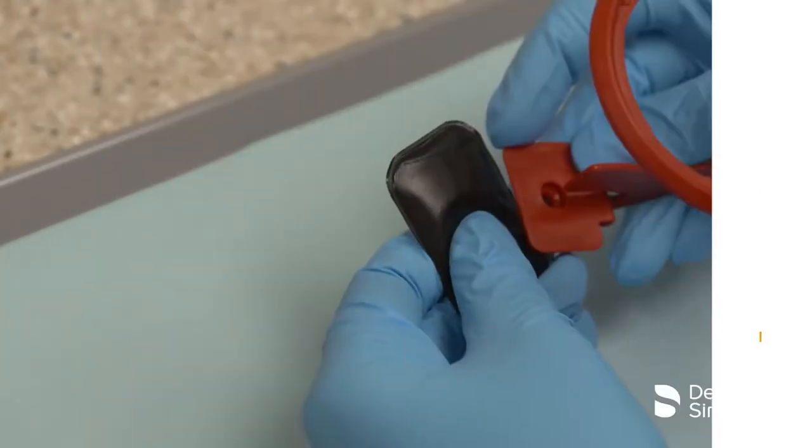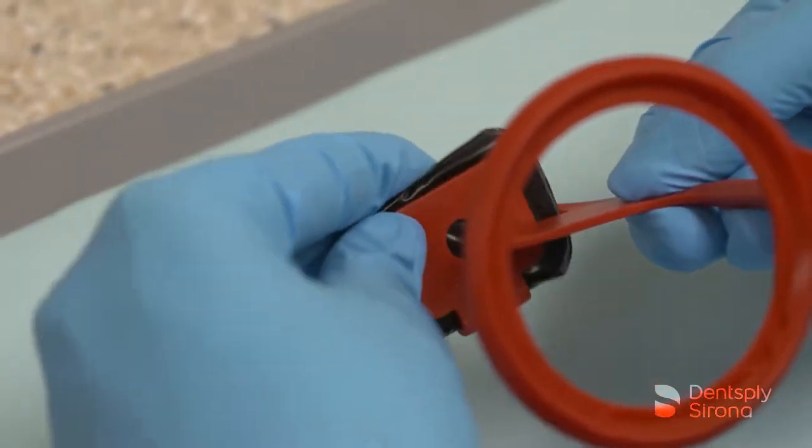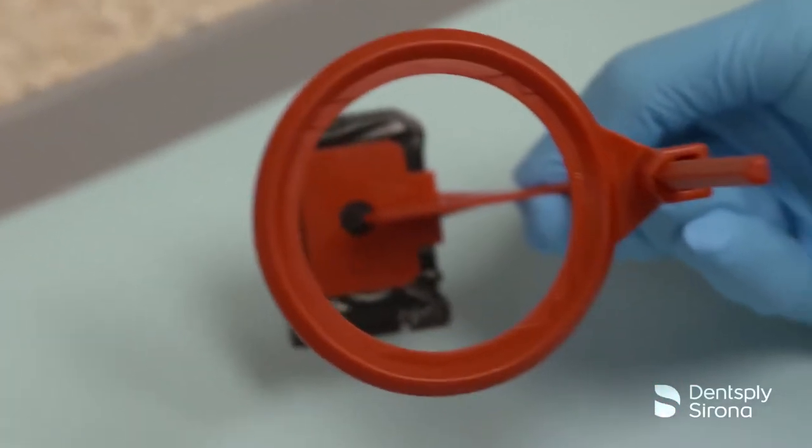The Flipray bitewing phosphor imaging plate holder is red in color, and this single holder will flip easily for clinicians to switch from a horizontal or vertical bitewing image depending on the patient presentation.